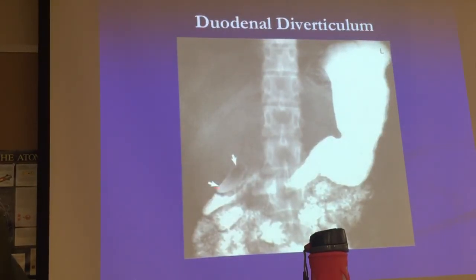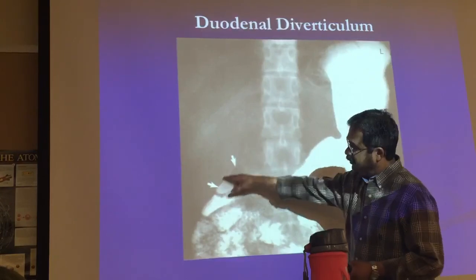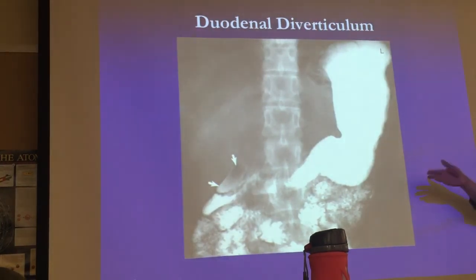Take a look. This is a big diverticulum. A lot of times people think diverticulums can be small. What I just referred to, I said something going on here. A big diverticulum there. Okay. A diverticulum is just a pouch that comes off typically intestines, but it can be anywhere in the digestive system. It's just a pouch.